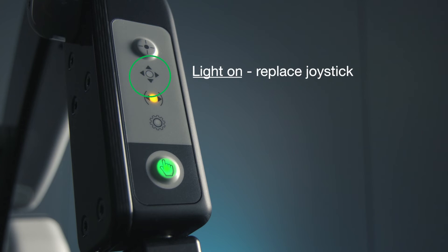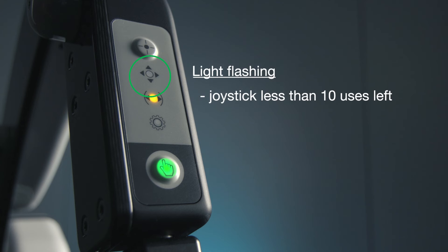If this icon is lighted, the connected joystick is defective or above its lifetime of 150 applications. If flashing, the joystick has less than 10 uses left. If steady blinking, the connected joystick has less than 5 uses left.